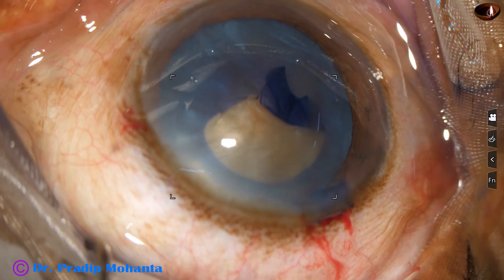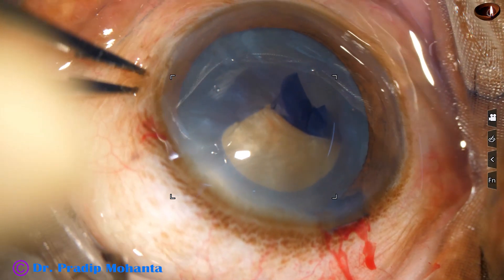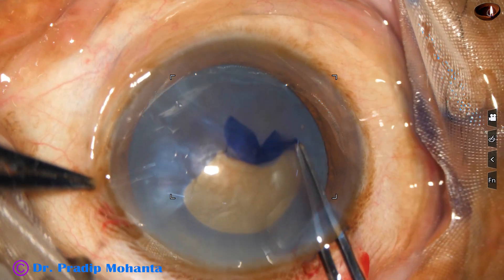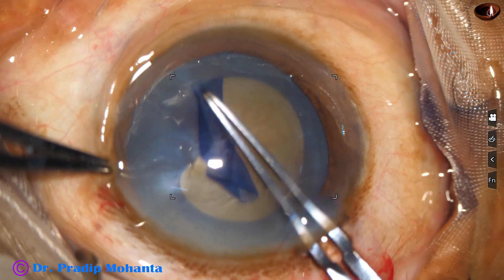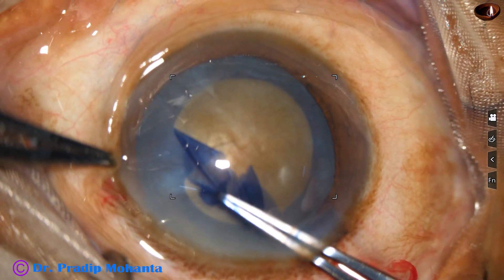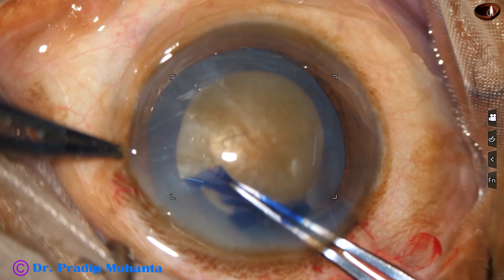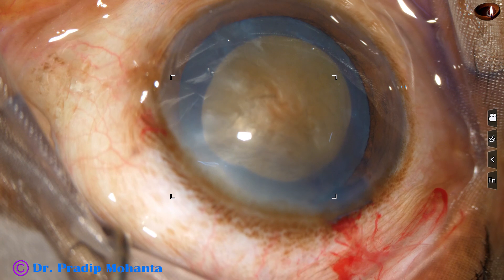To get the eyeball straight, I have to use a tooth forceps — a fixation forceps. Now I can see better and I can do a nice rhexis. However, this rhexis is becoming small, so I go a little peripherally, deliberately, and make the rhexis a little bigger.